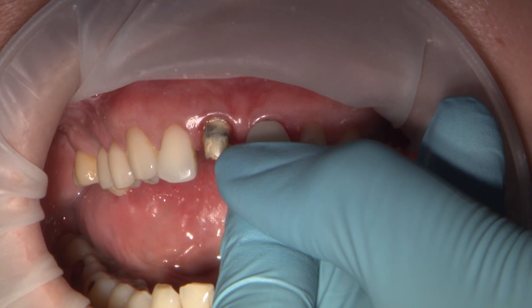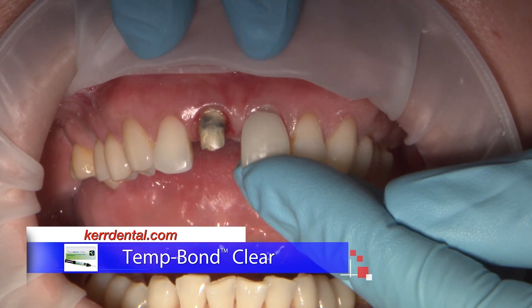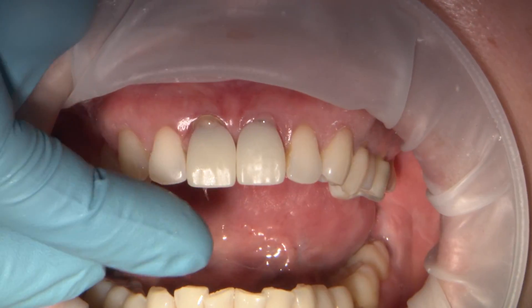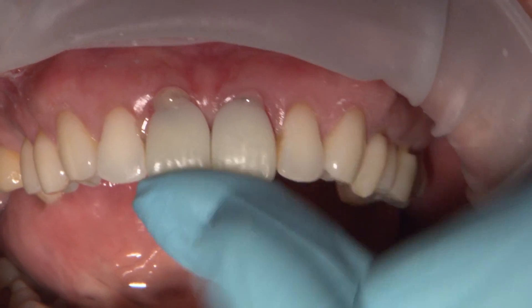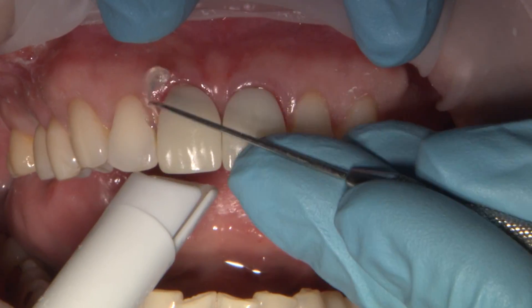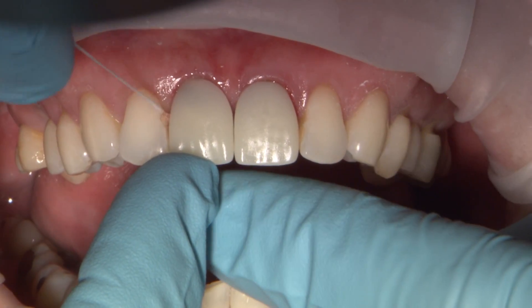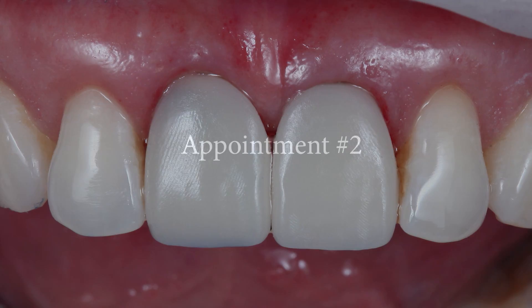These Biotemps are now temporarily cemented using Temp Bond Clear. The excess clear cement is extruded beyond the margins. This cement does have a light activation component — with a few seconds of light curing, the cement accelerates into the gel phase, making clean up a breeze. This is one of my favorite cements to clean up, as you can see how easily it separates off the margins in a very nice solid piece. With a floss knot, you can see how effectively the interproximal areas can be cleared out.